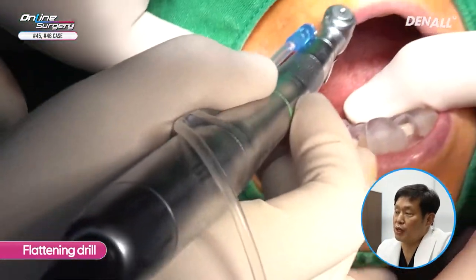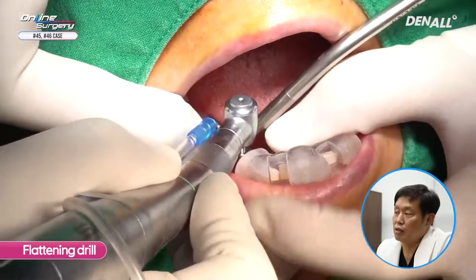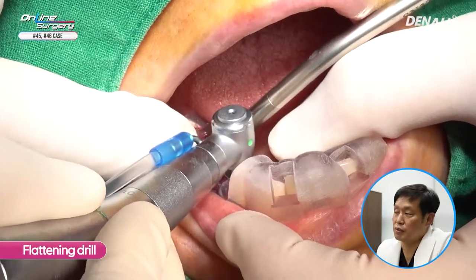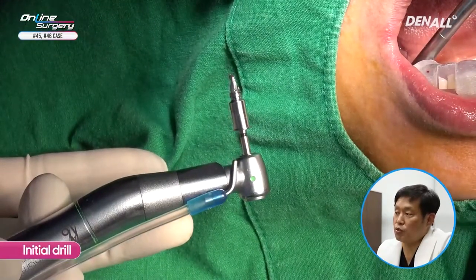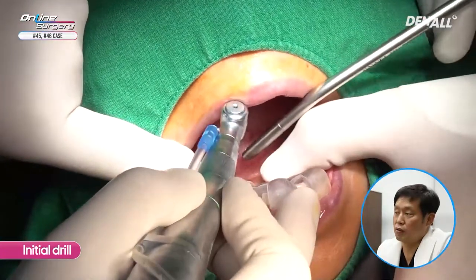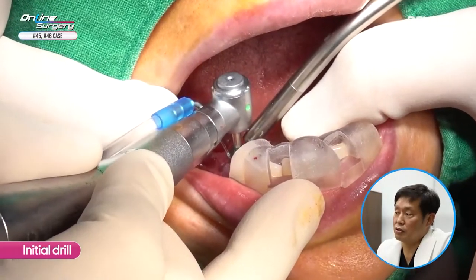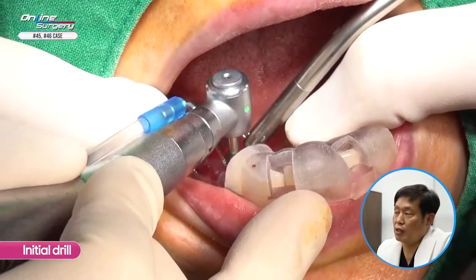Because implants were to be placed, the D flattening drill was used to flatten the superior portion. In number 45, initial drilling was done. In order to prevent excessive heat generation on the bone, pumping action was performed.